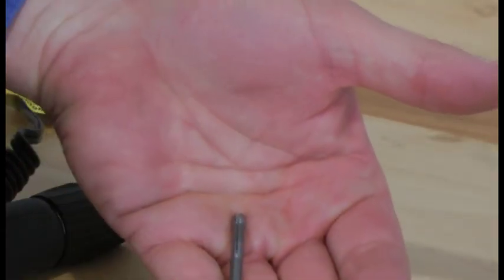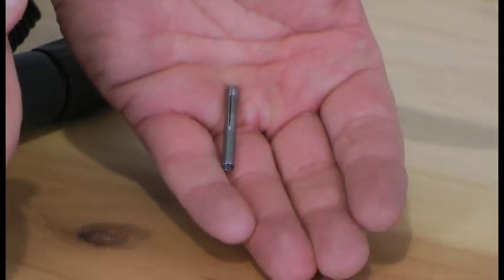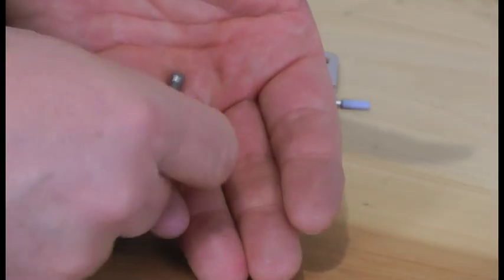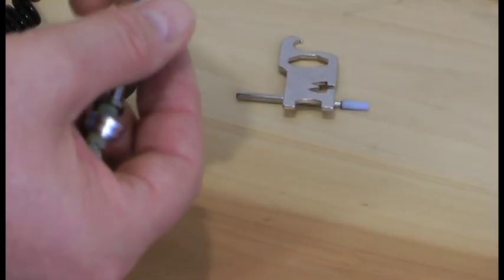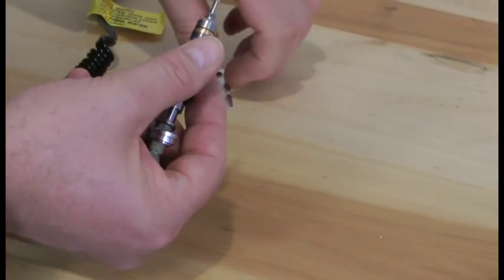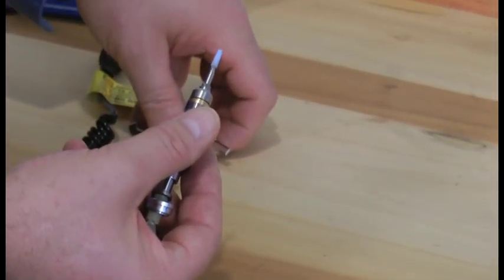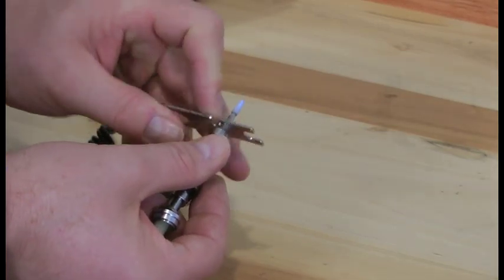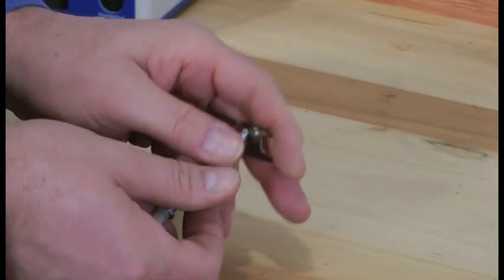And this is your collet. Now to put your collet back in and change another collet, you just simply put it in. Don't forget to put the burr shank in there. Tighten that up.